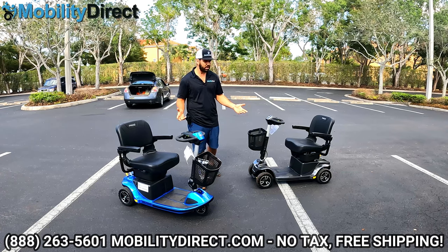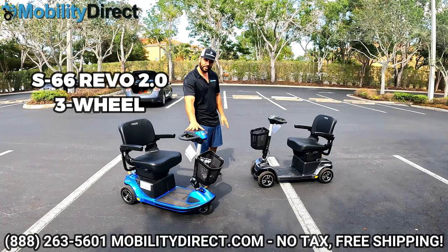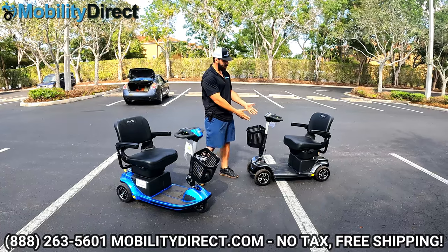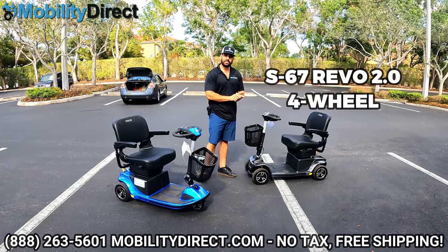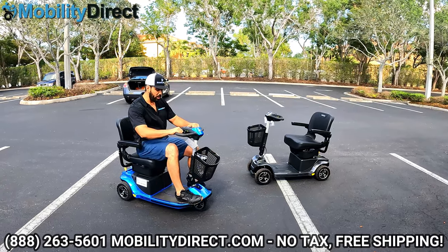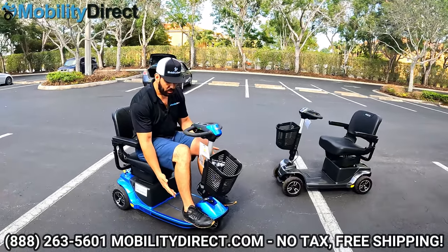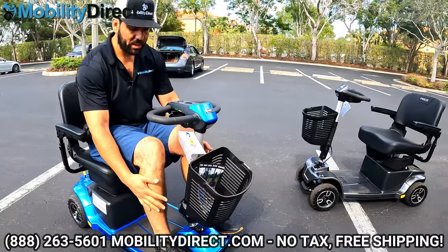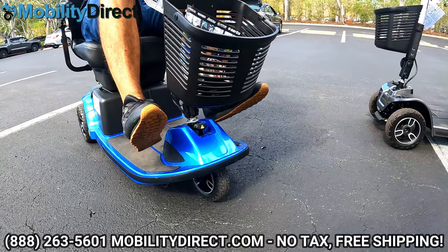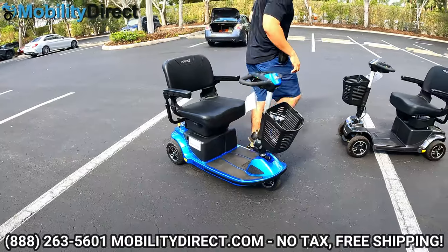As you can see, I have two different models here. They're both called the Revo 2.0. One is model S66, and it's in blue in a three-wheel configuration. You can get the three-wheel in gray as well, and I have the four-wheel version in gray, which is model S67. The main difference between the three and four-wheel is that with the three-wheel, you have a sharper turning radius and more room for your legs and feet — your feet can go around each side of the center steering column.